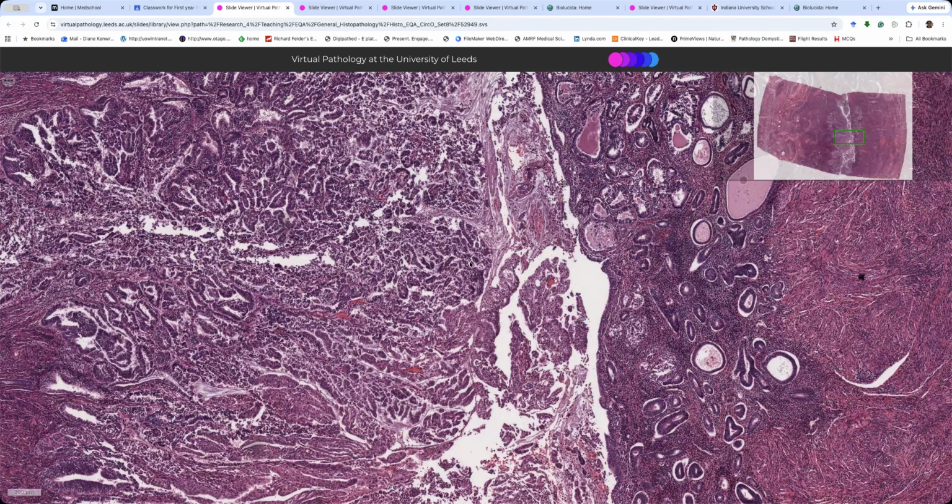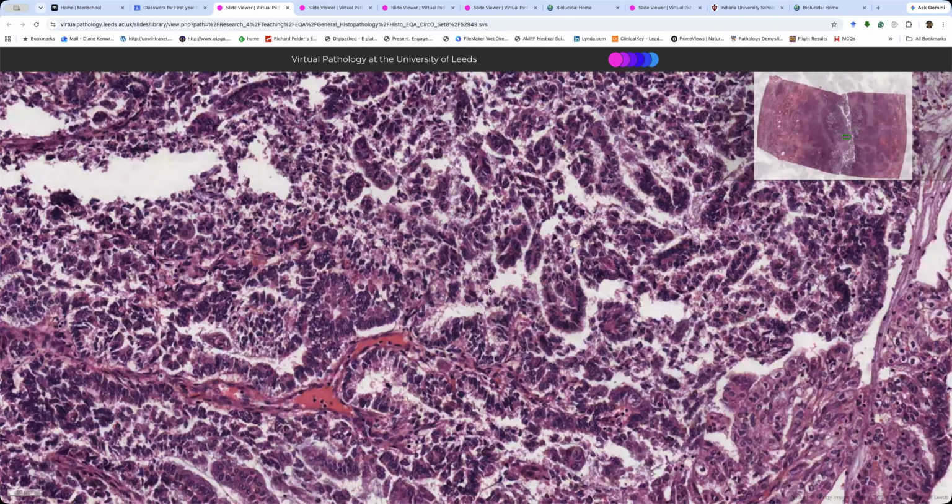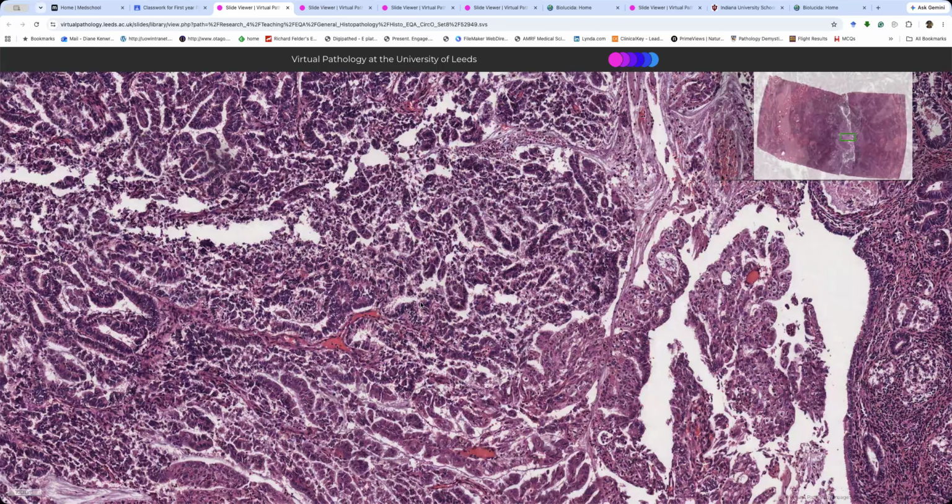But sometimes, if there's cancer, it undergoes autolysis while it's still in the person. So autolysis is not 100% the fault of the surgeon leaving it lying around for too long warm in theatre. Sometimes it just autolyzes. Okay, so we've got this autolysis, which makes it difficult to grade.